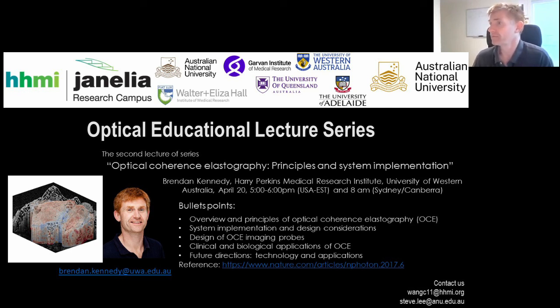You can get off-the-shelf systems in the megahertz range now. I think there's a company in Germany, Optores, who sell a 3 megahertz laser, but it's quite a big FDML system, and it's more expensive than we thought would be viable from a commercial point of view. The other consideration is probably the mechanical deformation. You need to be careful at the rate at which you're deforming the tissue. So ultimately, I think you can probably get this down to around 0.5 second with a clinically meaningful image. That's cool. Great. Thank you.